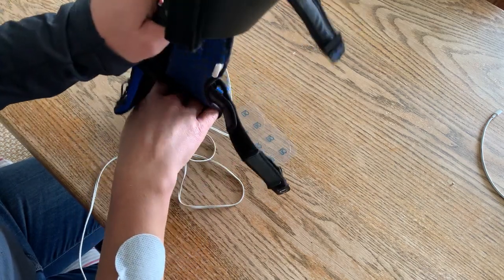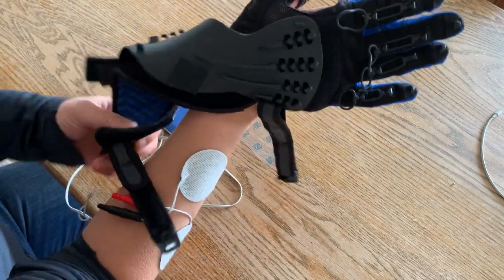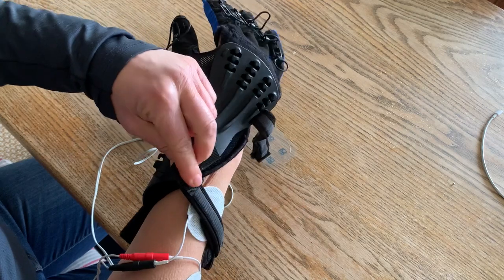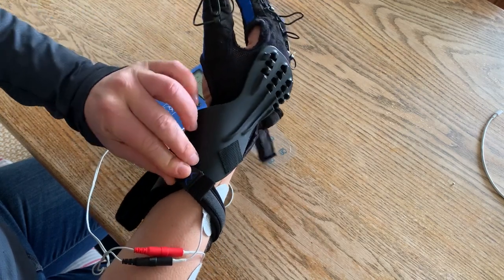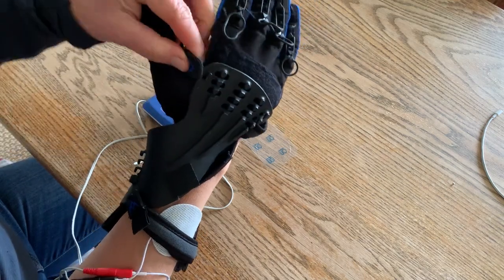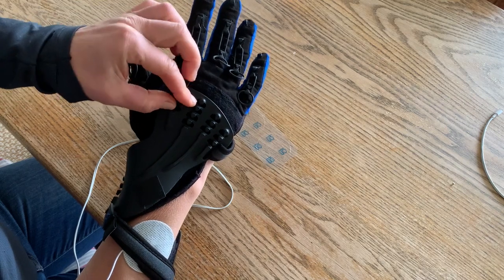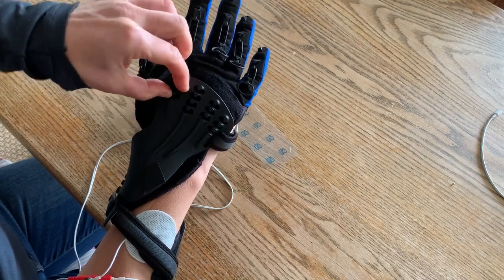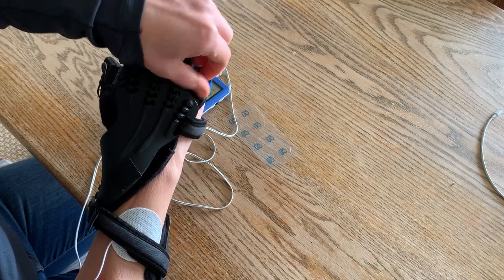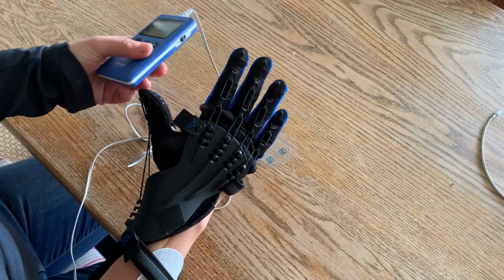Then put the glove on — fingers in first. It's fine for the forearm strap to go across the electrode, and then just tighten the hand strap up. Obviously you don't have to copy these tensioners; it's however your Sabre Glove is set up to work.